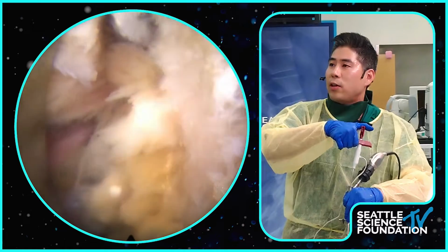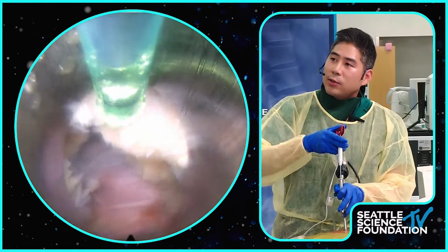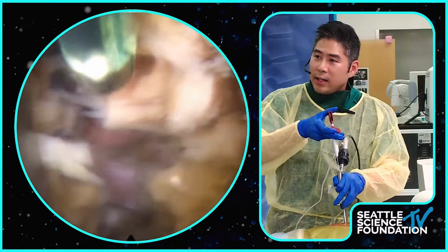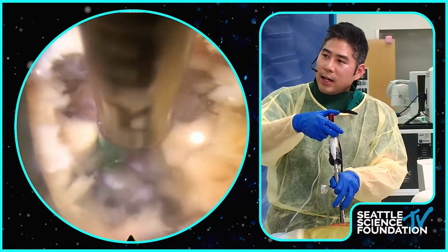That's the S1 lamina. You can see that this is the thecal sac in the midline. So this is the spinous process up here, and this is way past the midline here. And then this is the traversing root. This is the axilla of the root, and this is the shoulder.